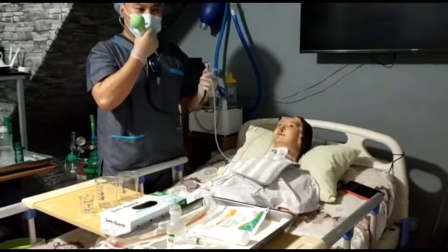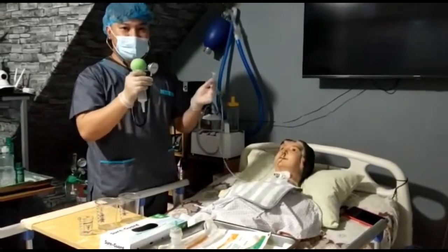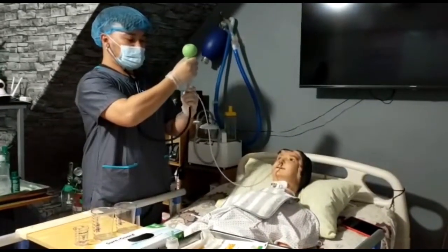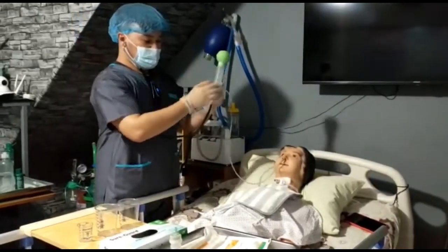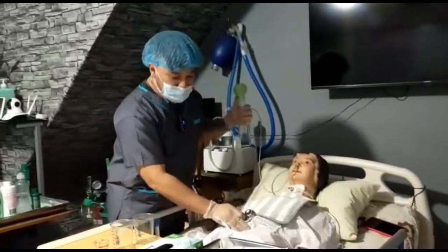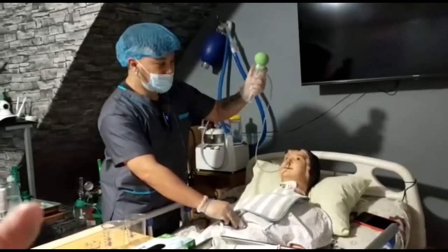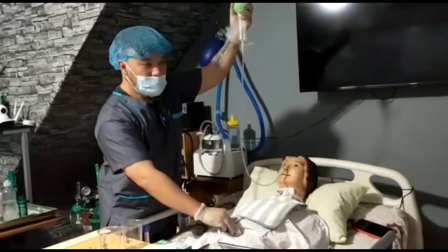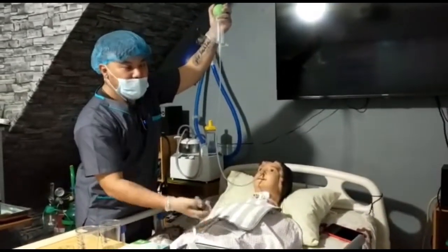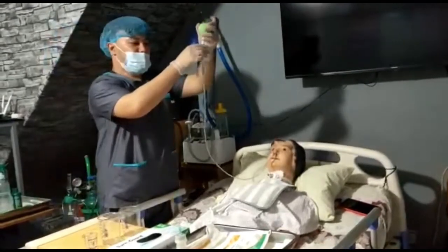So, ganito po ang pag-check ng NGT kung intact po siya using the aseptic syringe, itong NGT tube natin and this stethoscope. Gagawin natin guys, ipapaste natin itong stethoscope sa taas po ng kanyang navel. At pakikinggan po natin kung meron gurgling sounds. Magpapump po tayo ng dalawang beses. Kung meron po siyang gurgling sounds, ibig sabihin po intact siya. So this is good for feeding. So upon checking po, ang next na gagawin natin is we can start correct feeding na.